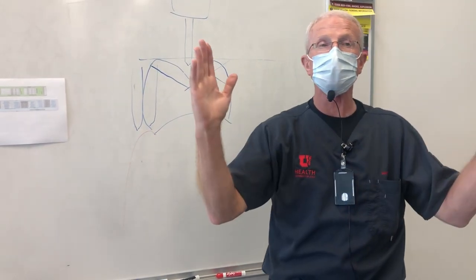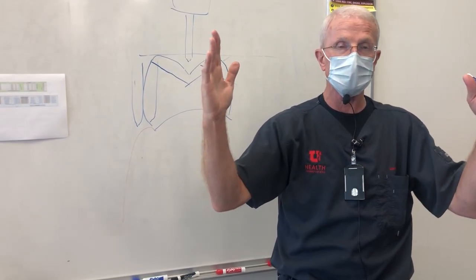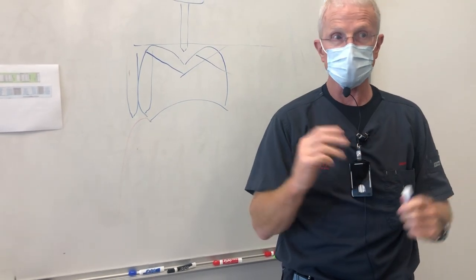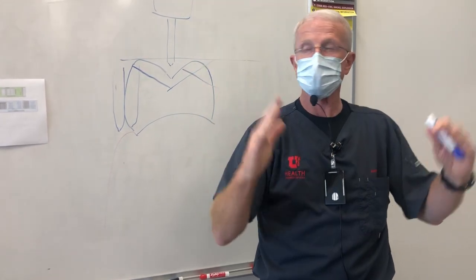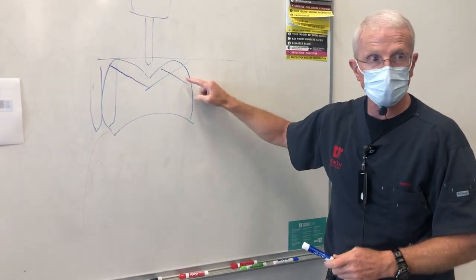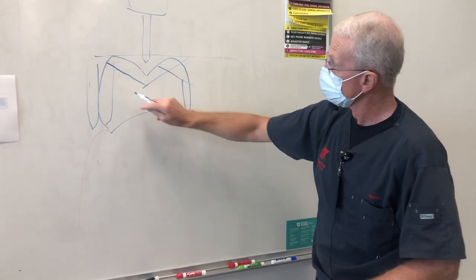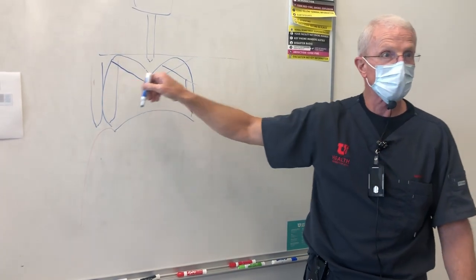We allow you to be a little bit over tapered because of the shape of those adjacent teeth, but we don't allow you to take too much advantage of that, or you'll really over taper it, right? So stay close to those adjacent teeth. You'll end up just a little bit over tapered. That's okay. And then when you get to the lingual aspect, you simply line up your bur with your buccal axial wall, and you add the lingual axial wall.